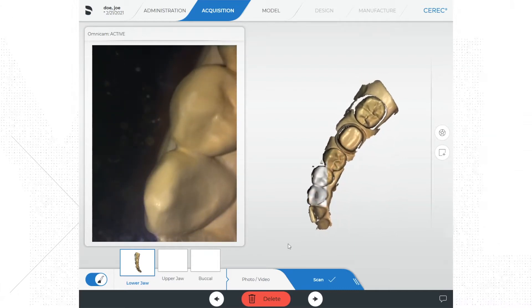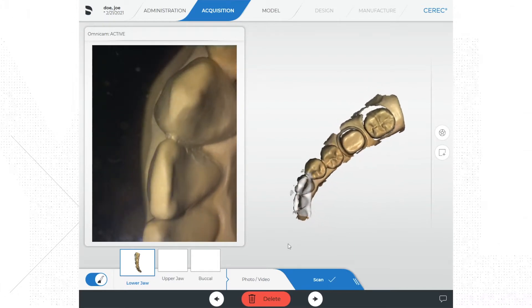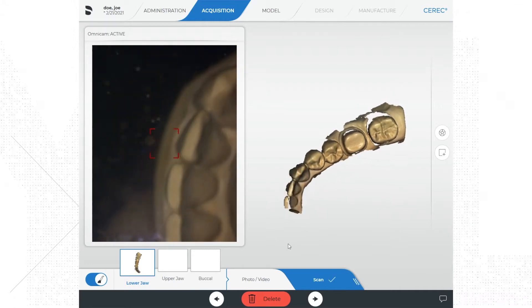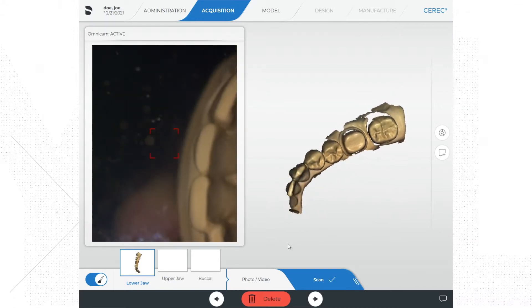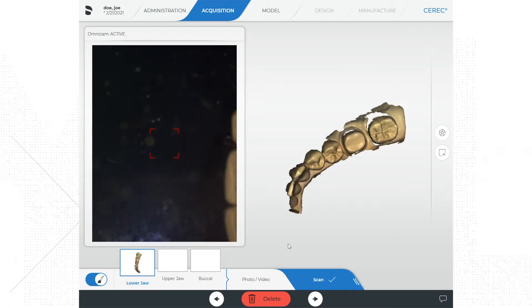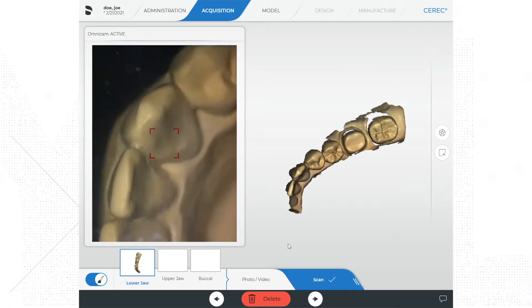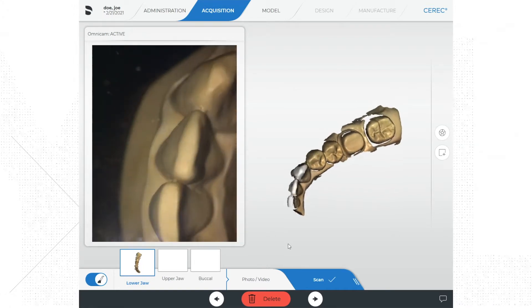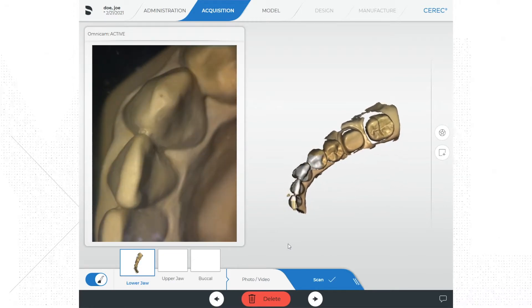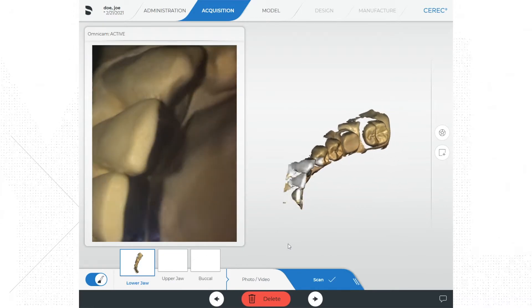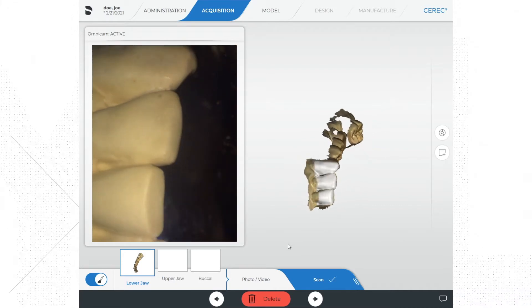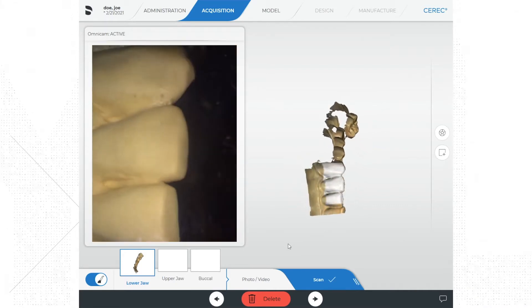When the sound changes, simply go back to where you were in the scan when it was still scanning well and pick up where you left off. Most of the time you are moving too fast, you're too far away from the teeth, or the lens is starting to fog up. I always like to scan up to the midline when working in the back; at a minimum I would at least scan up to the canine.